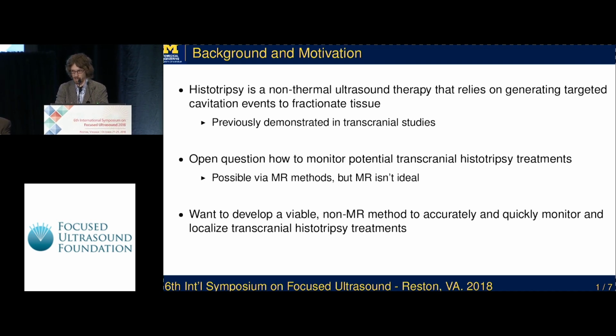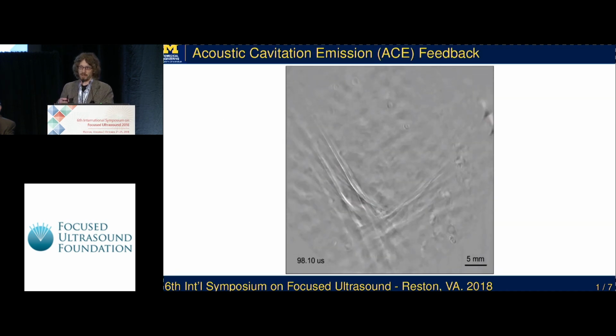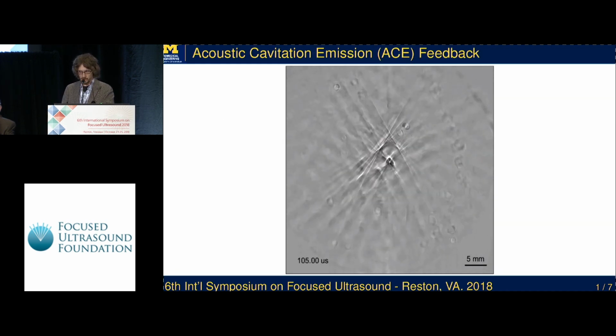But it's an open question how you monitor these treatments in transcranial therapies. It's possible via MR methods, but histotripsy is not a thermal therapy, so MR isn't really ideal. And you want to be able to monitor pulses on a pulse-by-pulse basis because every single one is able to do damage. So we want to develop a method that can reliably localize and monitor treatments in real time that isn't MR-based. The way that we are working on doing that is using what we call acoustic cavitation emission feedback.